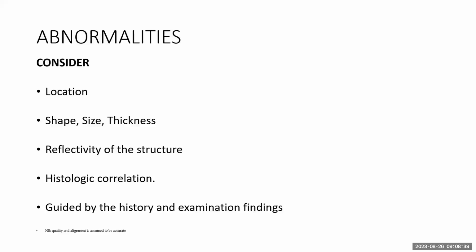The investigation, the OCT investigation, adds to it. It doesn't take preeminence. So if someone sends you an OCT and you say, this is epiretinal membrane, that's it. But the question is, what is the cause? And that's what you have to answer.